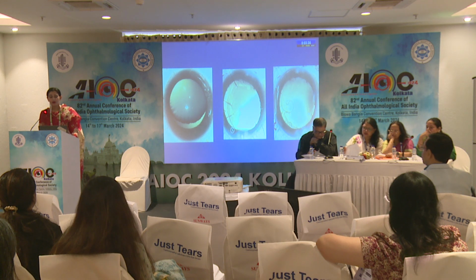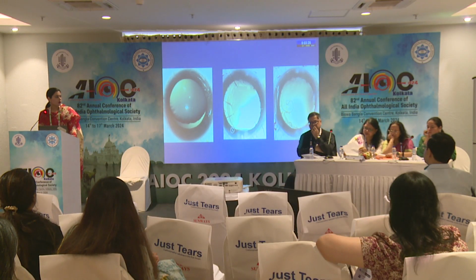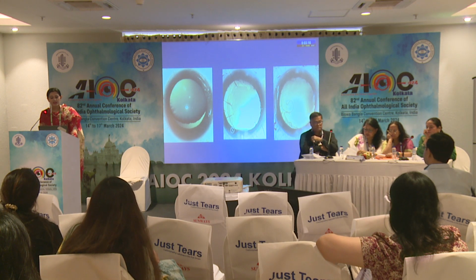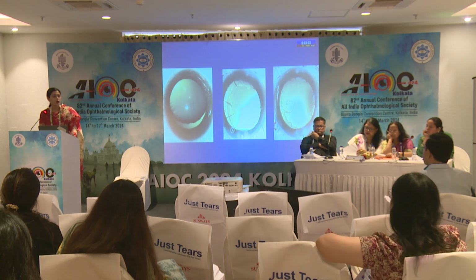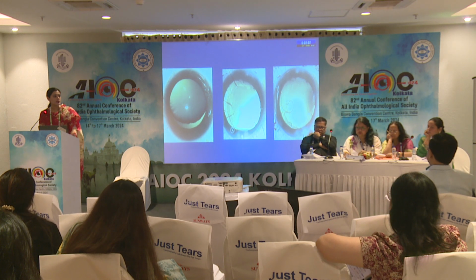Nowadays, cataract surgeons have a multitude of options in their armamentarium to facilitate an IOL implantation. These include a scleral fixated IOL, glued IOL, Yamane technique, AC IOLs, and many others. However, one of the main advantages of using an endocapsular device is that we preserve the capsular bag. That is, we maintain the physiological compartmentalization between the anterior and the posterior segments of the eye. We do away with the need of a vitrectomy and possibly any vitrectomy related complications. Most importantly, we get to place the IOL in the most anatomical position, which is the capsular bag.